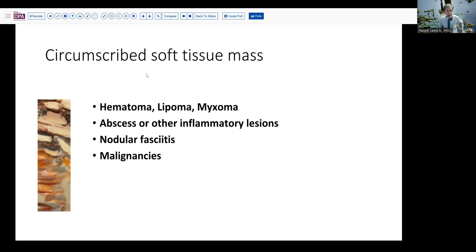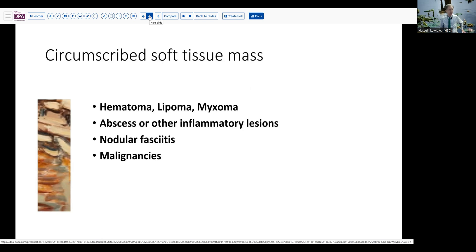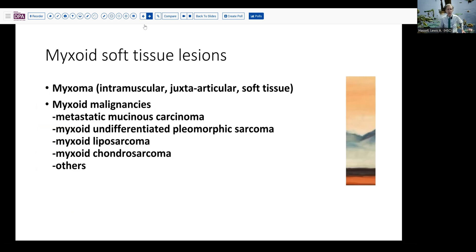So in this patient, needle aspiration was done, which produced a fairly abundant myxoid mucoid material, relatively sparse in cellularity, but mostly bland spindle and stellate cells without much in the way of distinguishing characteristics. So with the appraisal that it was a myxoid lesion, that changes the differential consideration a little bit. We mentioned the benign lesions — the intramuscular or juxtaarticular myxoid lesions could be a consideration, such as soft tissue myxoma. And then there are a number of malignancies, which can have myxoid features on needle aspiration and, of course, surgical resection.